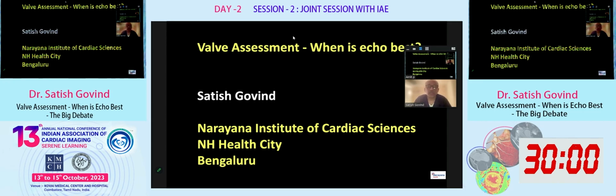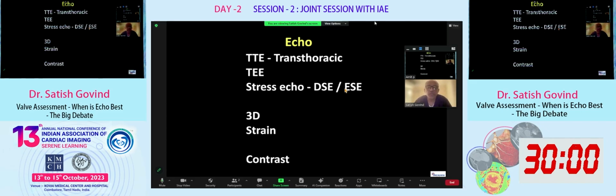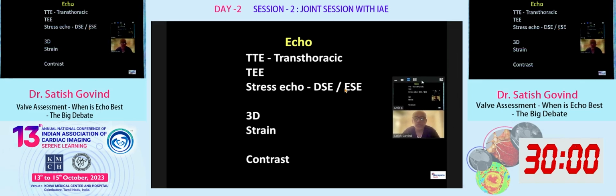Now, coming to the topic itself, we had a wonderful talk by Dr. Johan, and he emphasized the various aspects of MRI. So I'll be looking at it from the other side. How does echo fare in terms of valve assessment? When you are looking at the echo itself, there are many parts of the echo. It starts from transthoracic, and then it moves on to transesophageal echo. Then we have stress echo, dobutamine stress echo, exercise stress echo, and then we have 3D strain. And in a very limited way, contrast also is sometimes used.